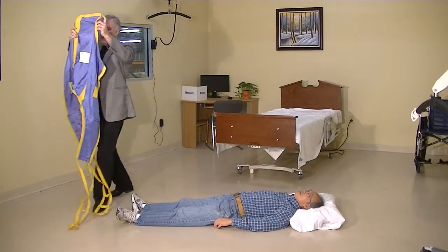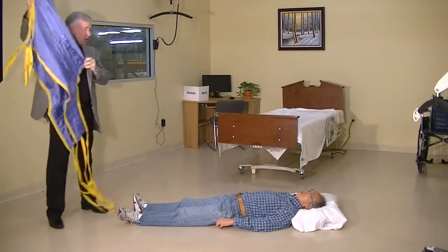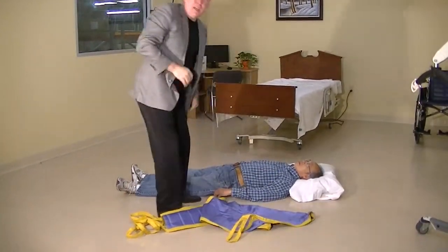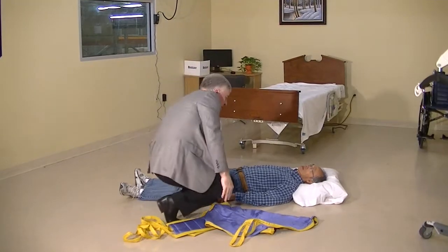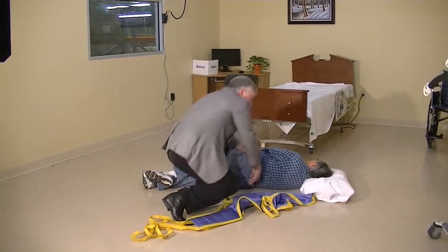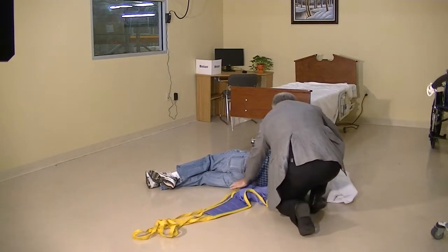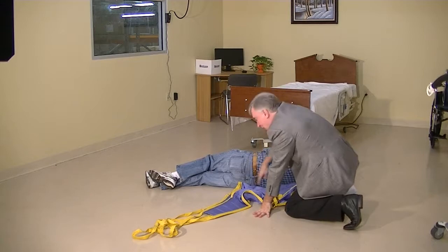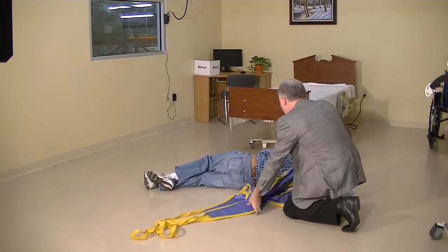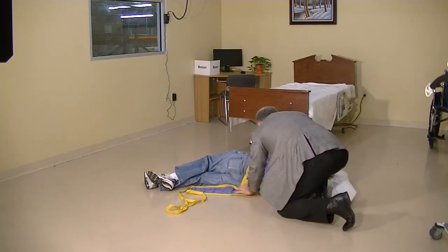So how do we apply the sling? We're going to fold the sling in half with the instructions on the inside, and we're going to do a very similar transfer to what we did with the person in the bed. We're going to lift up the leg, roll the person over, take the sling, and apply it to the patient — folded in half, lining up the bottom of the sling to the tailbone area, with the top of the sling to the head, and flip the extra material over the person.